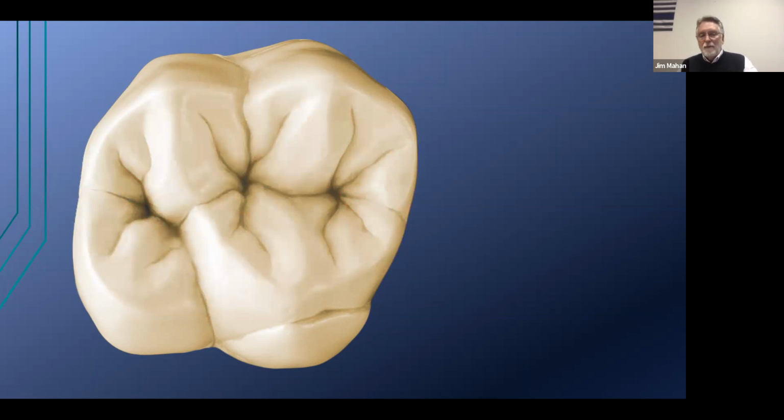So if someone would have carved this tooth or would have designed this tooth using a particular library, PTC happens to have 4 libraries that go into the 3Shape system, I can make a judgment call based on, does it look like that? If it has some type of anomaly to it, or it's a little bit different, I'm always going to be thinking of this tooth. And then, based on what did you have to do as an exception to get the anatomy that is required by this particular case? And it's always just a small move in one direction or another.